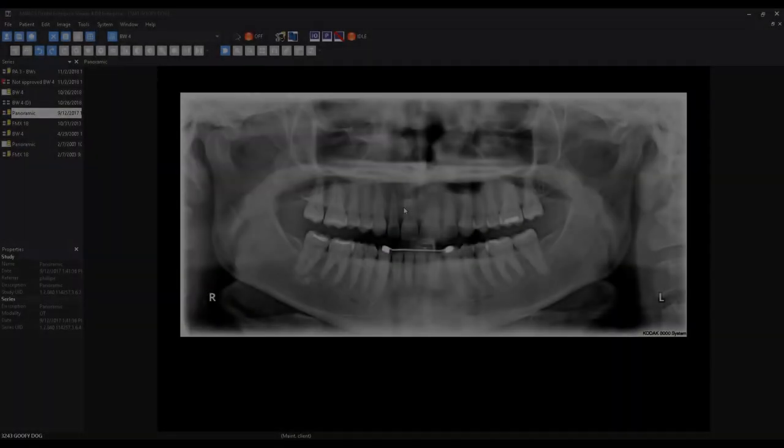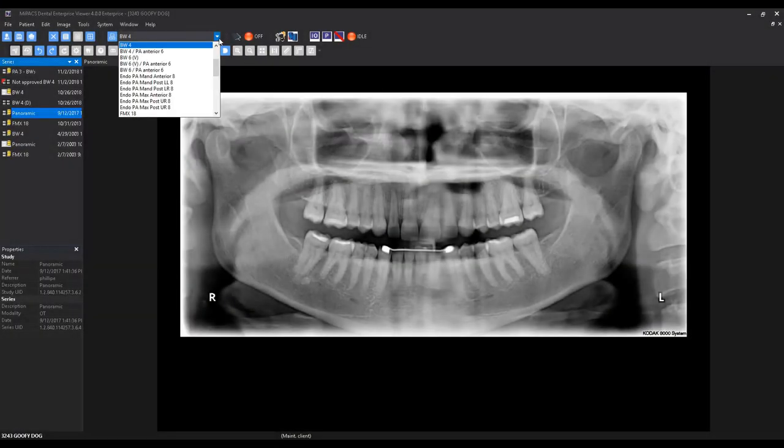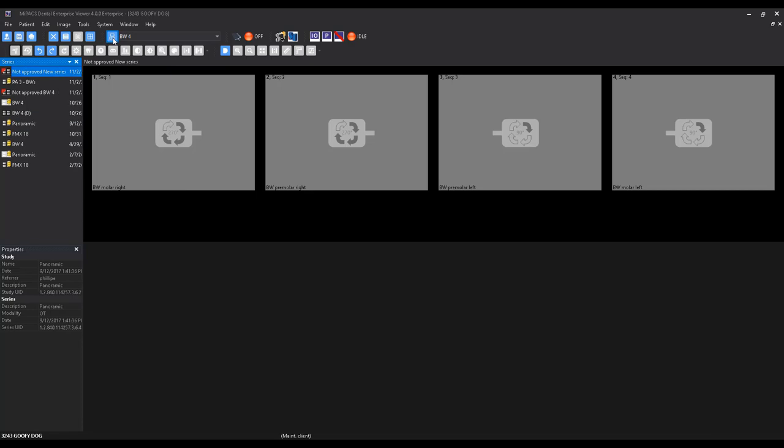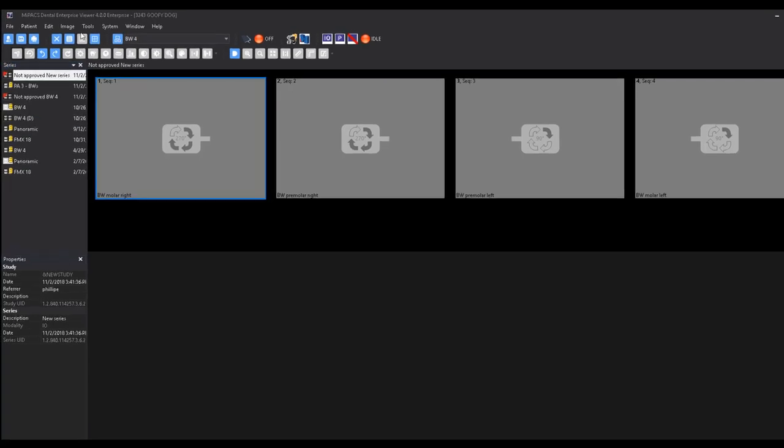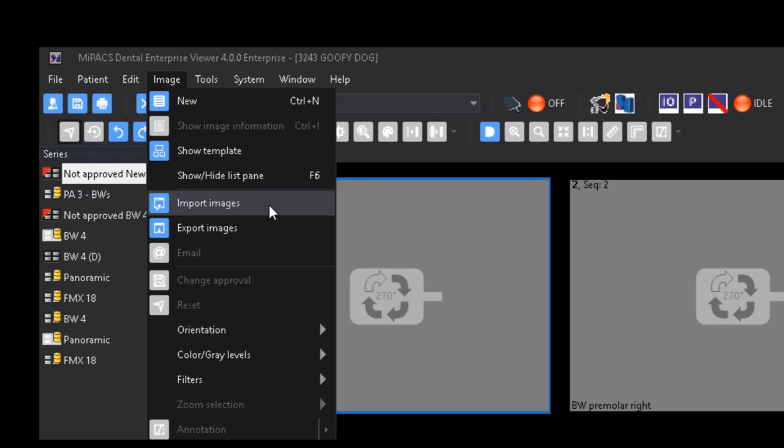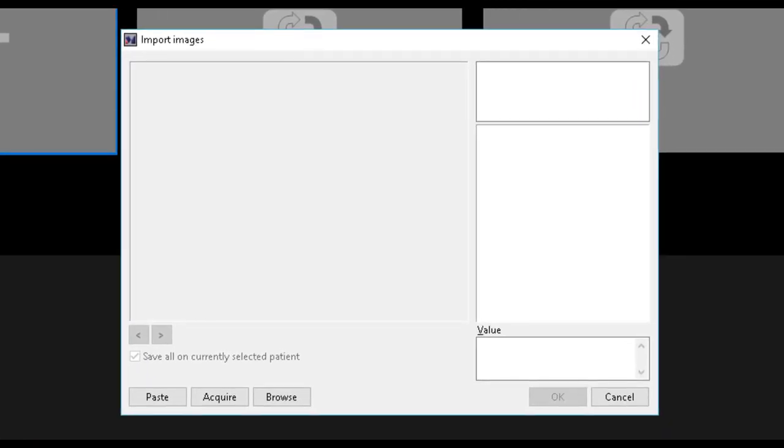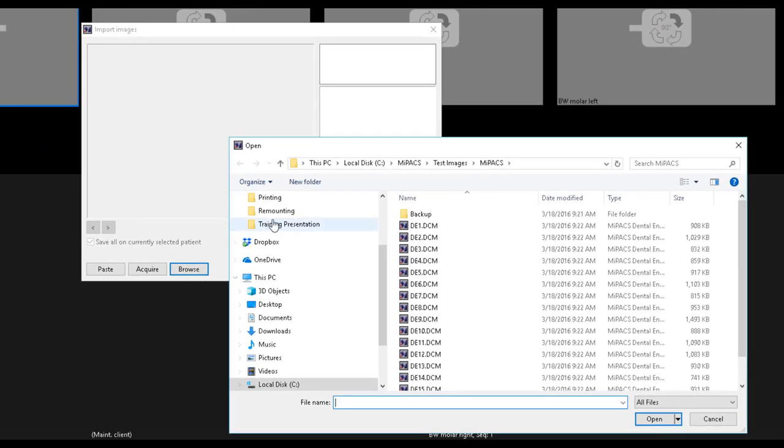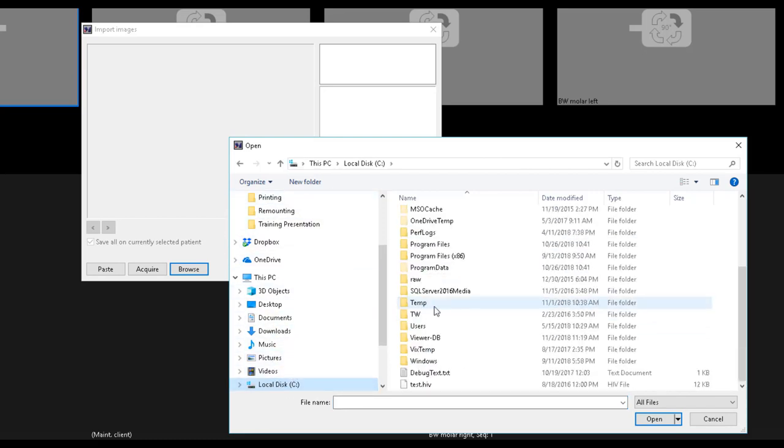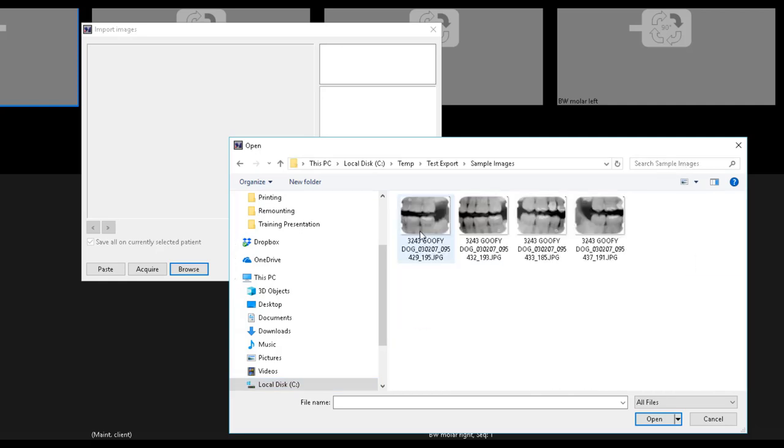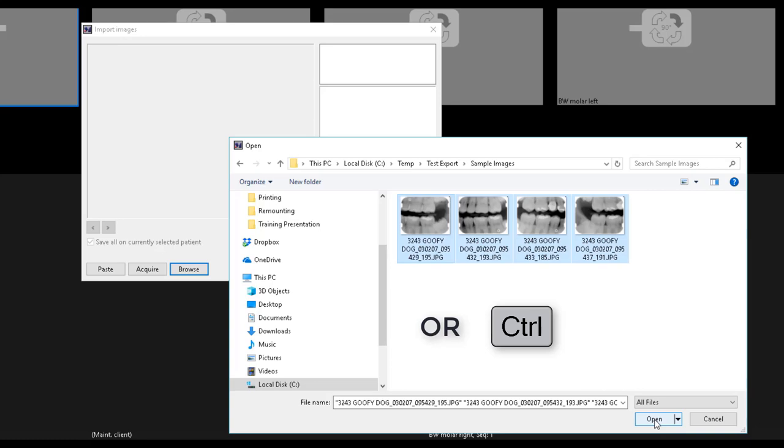The MyPax viewer is capable of importing both DICOM and non-DICOM image files. To import a non-DICOM image, you will first need to have a patient record open and a template selected. Select Image, Import Images, and click the Browse button. Navigate to the image or images you wish to import.